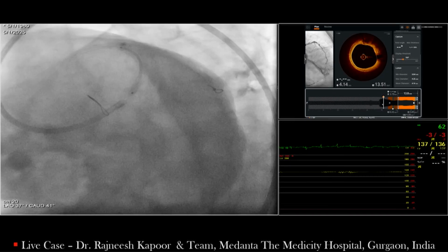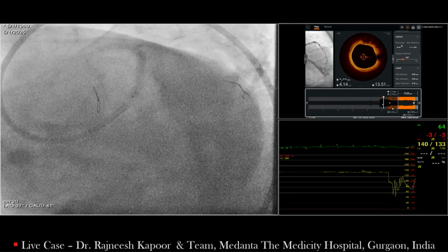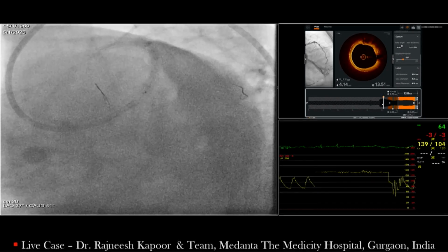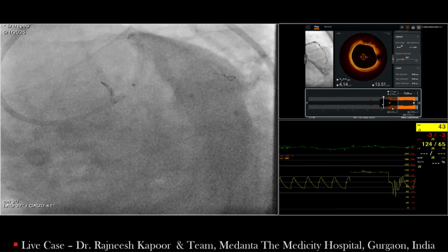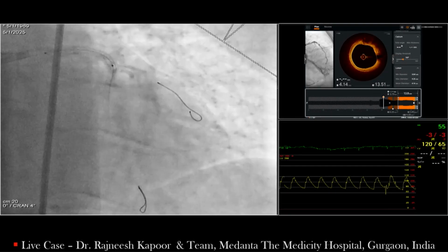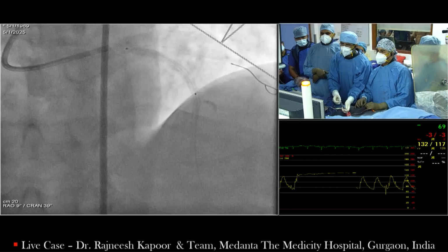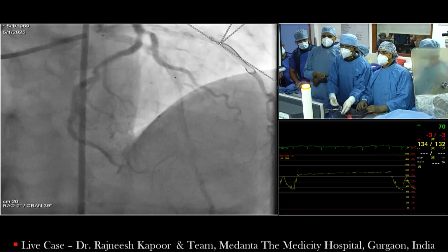10, 12, down. Down, down, down, down fast. Come epicranial. Have we taken that? Take shot. Okay.